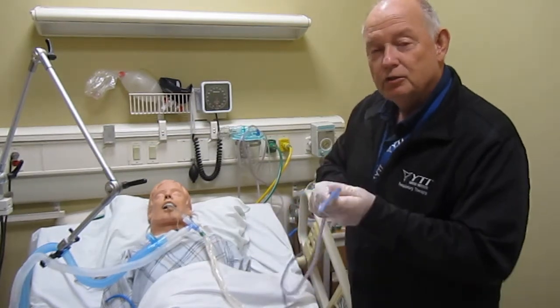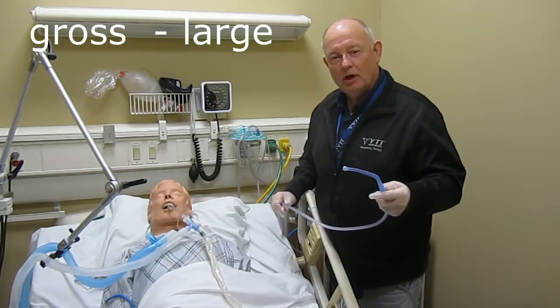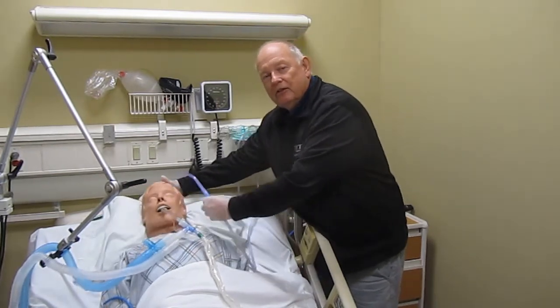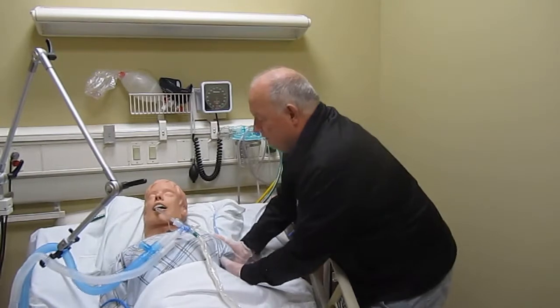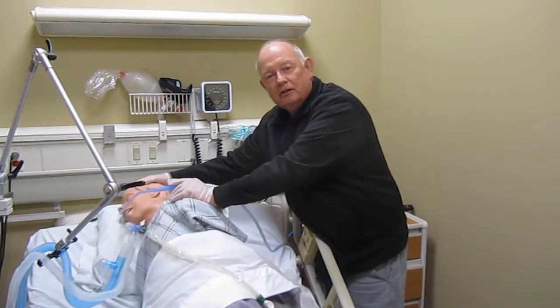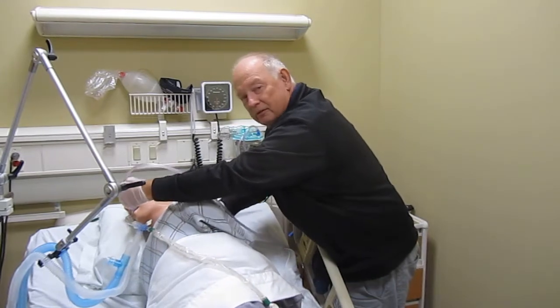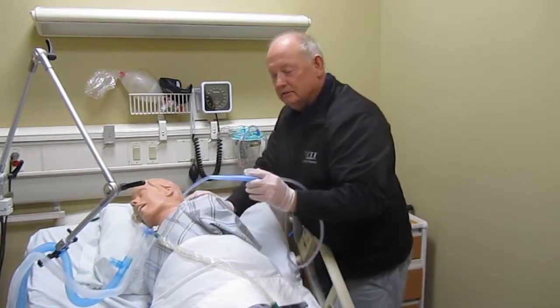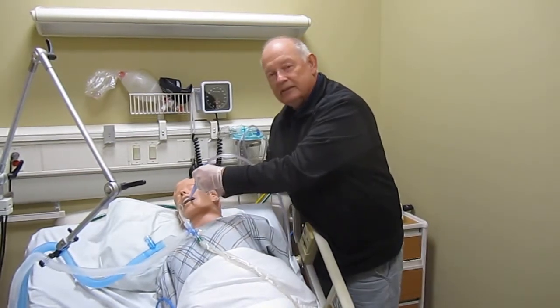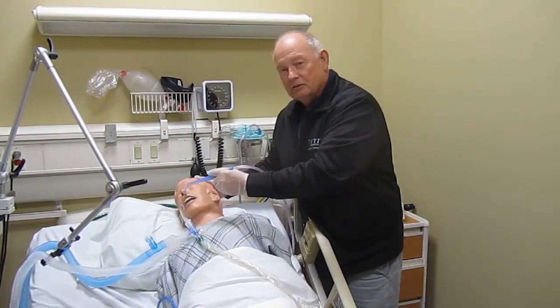We use this to suction gross secretions out of people's mouths. The word gross meaning large quantity. If a person is throwing up, you put his head over to the side so he throws up out of his mouth. Roll him over so he throws up over the bed and suction the mouth so he can breathe again. If he's coughing and secretions are in his mouth, stick that in his mouth. Suck up all those secretions. Get some of his nose.